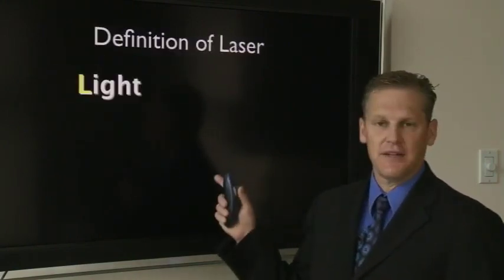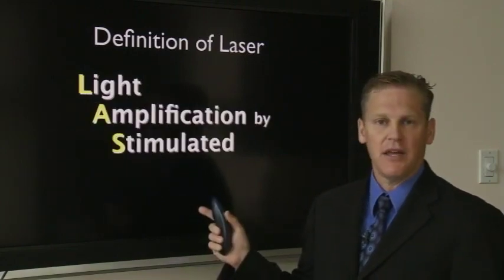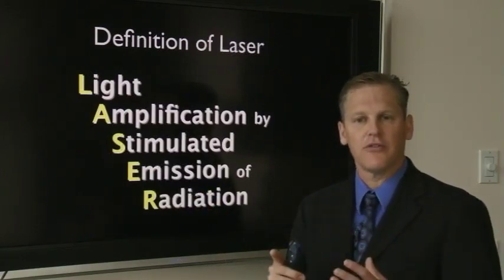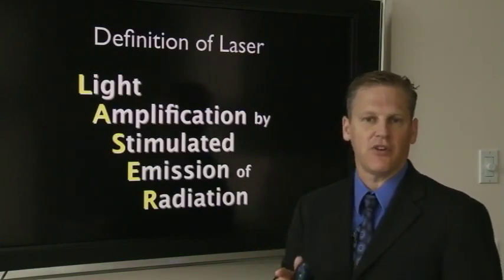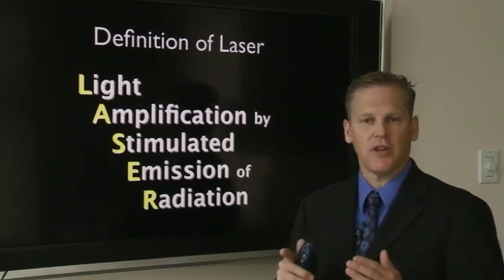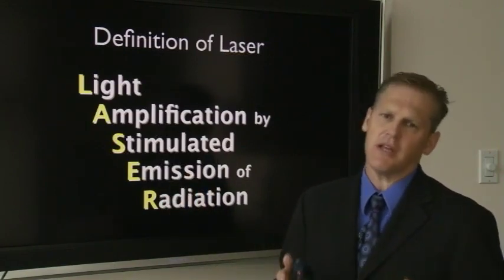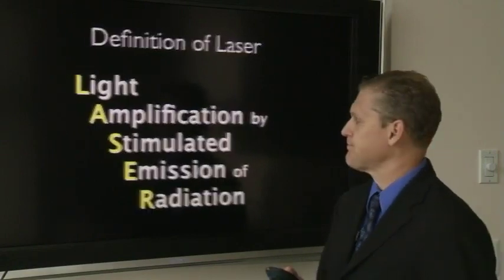Laser stands for light amplification by stimulated emission of radiation. People get concerned with the term radiation, and you should understand that lasers are actually non-ionizing radiation. They're non-damaging to cellular DNA. So it's important to remember that when you are using laser, yes, you are stimulating an emission of radiation, but it is not going to be damaging to the patient. Patients are pretty comfortable with lasers, and laser eye surgery really has brought that forth.